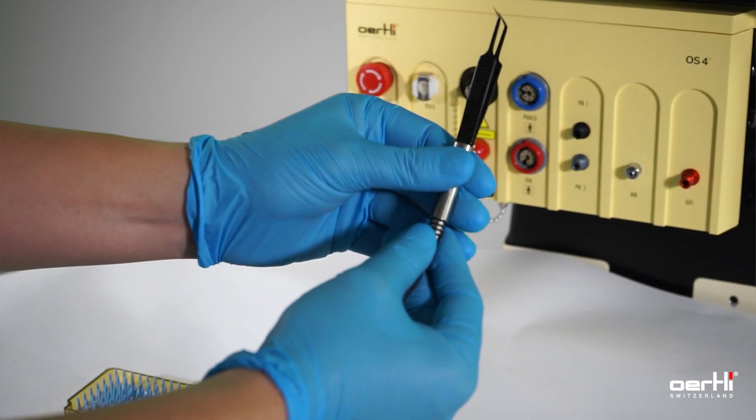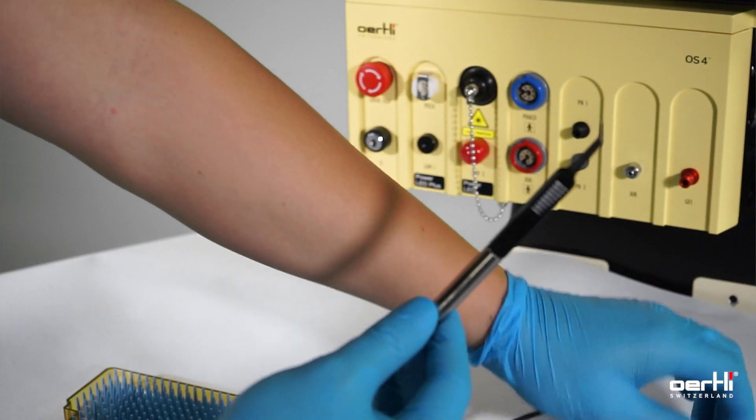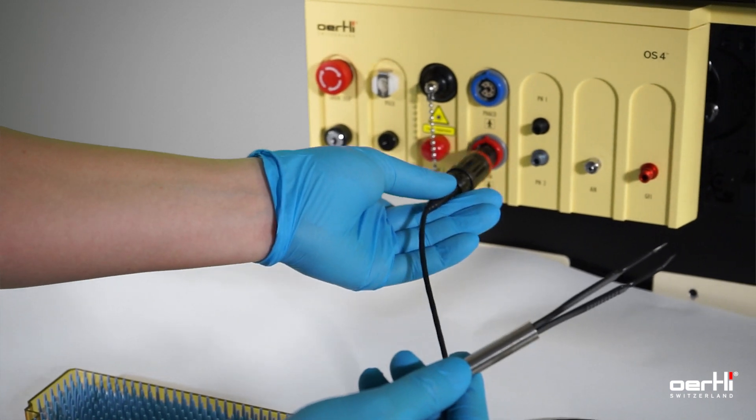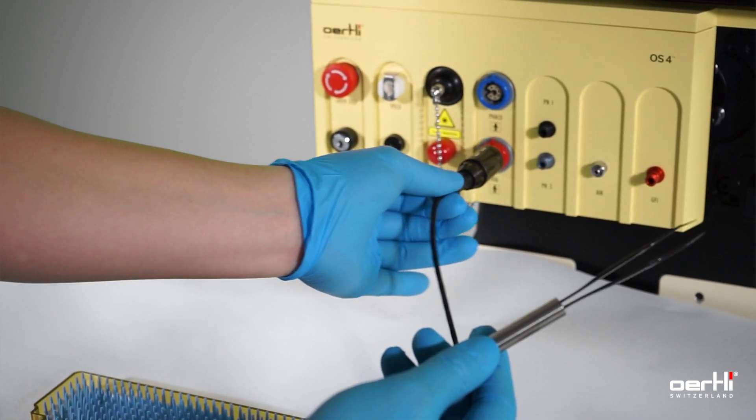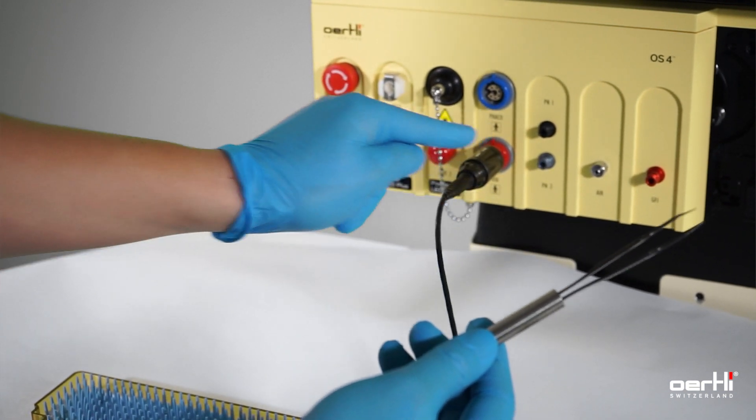First, attach the tip and then plug the handpiece to the device, and pull for double checking to prevent losing the connection.